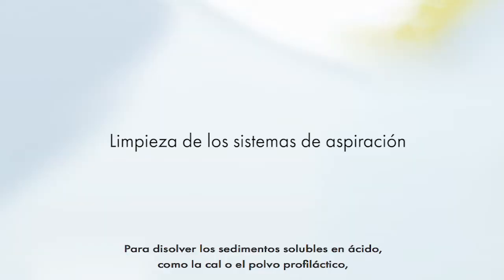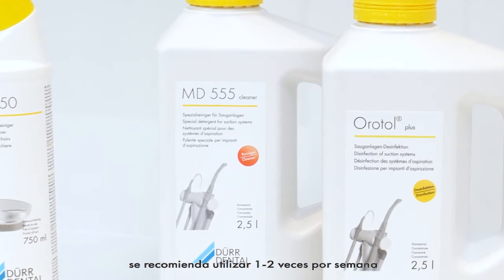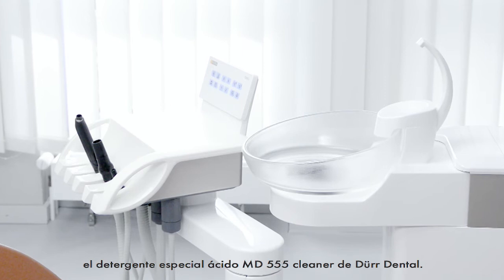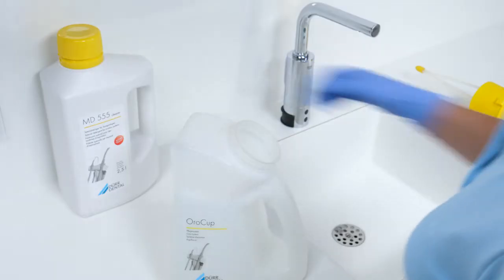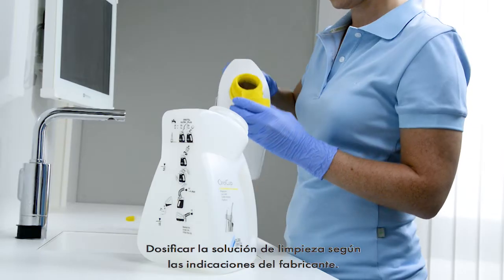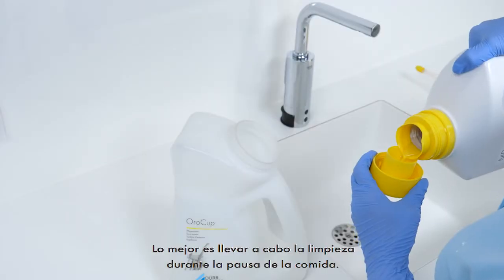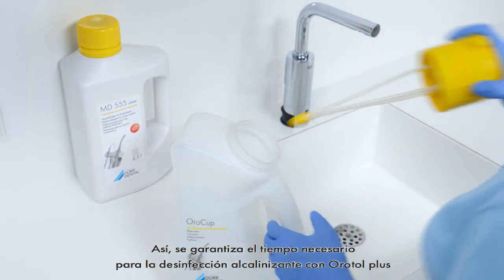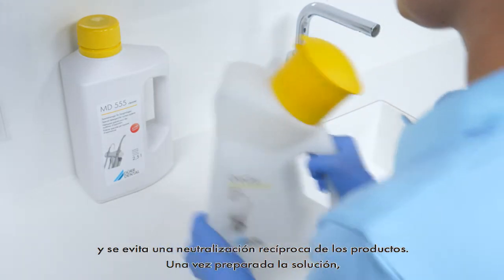Cleaning of suction units. To dissolve acid-soluble deposits such as scale or prophy powder, we recommend using the Acidic Special Cleaner MD555 Cleaner from Der Dental one to two times weekly. The cleaning solution must be dosed according to the manufacturer information. The cleaning should preferably be carried out during the lunch break. Thus, the necessary time interval to alkaline reacting disinfection with OroTol Plus is guaranteed and a mutual neutralisation of the products is prevented.